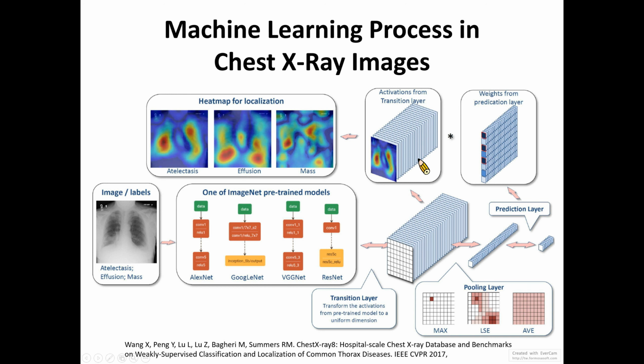Okay, so in this workshop, the data we provided is from the RSNA Pneumonia Detection Challenge. As I said, this challenge is for everyone to build an algorithm that can automatically detect potential pneumonia cases, and also to locate the actual position of the pneumonia.